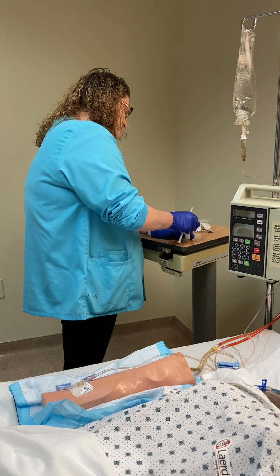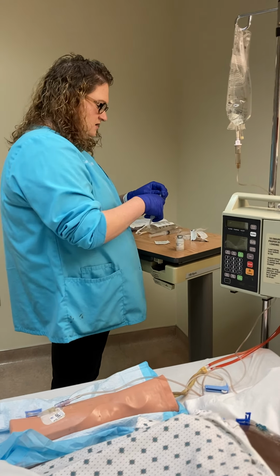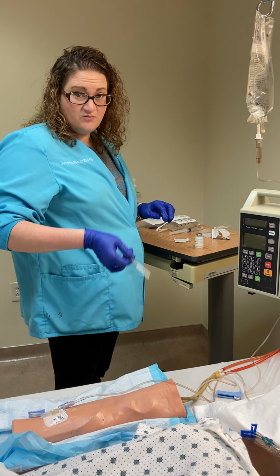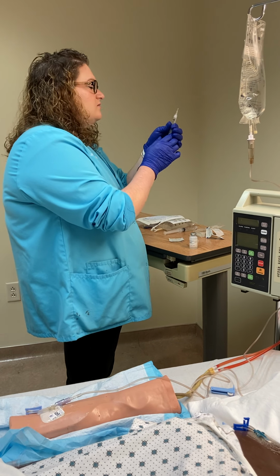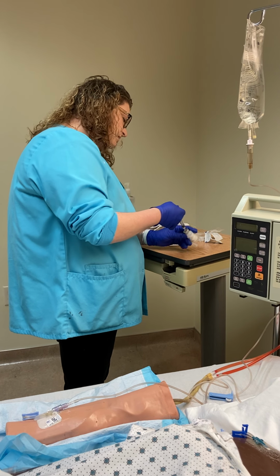Scrubbing 15 seconds on the vial. Now for a push straight through this line, if it is compatible, I do not need to flush before or after. If it's incompatible, we'll talk about that in a second.